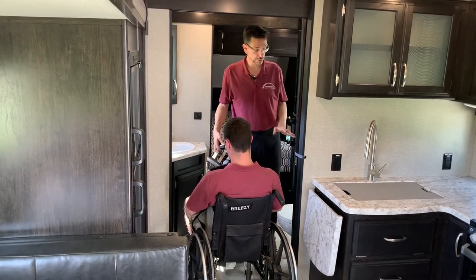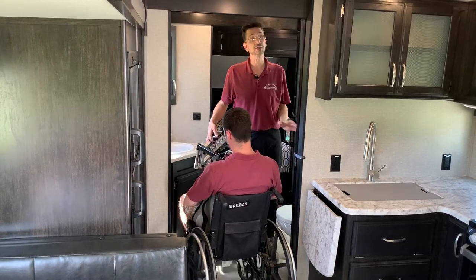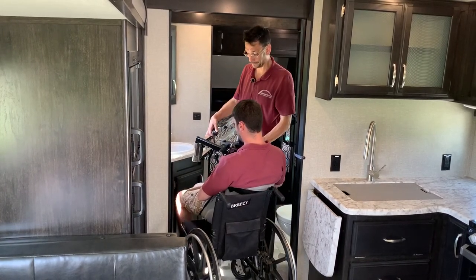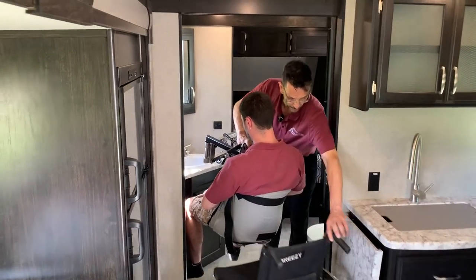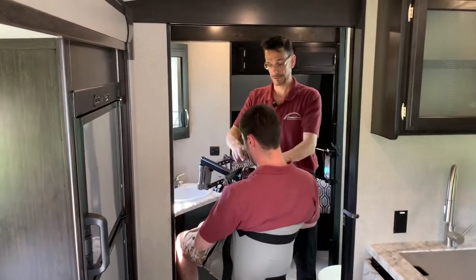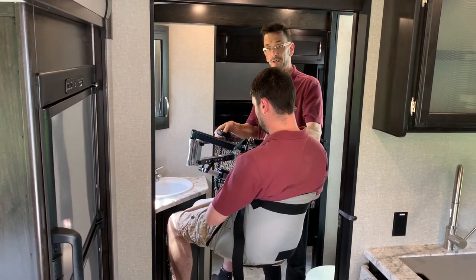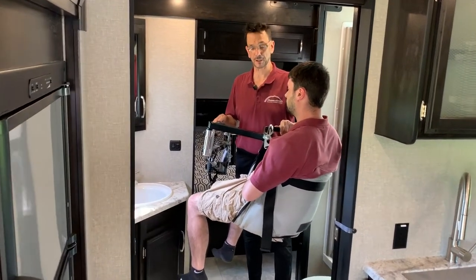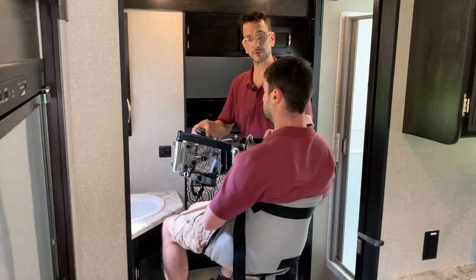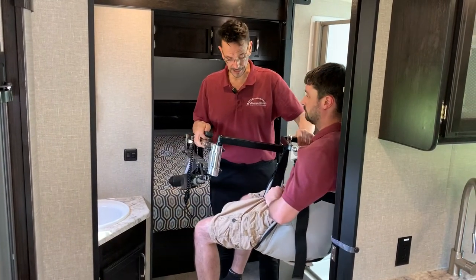Here we're going to show you how to transfer from the wheelchair onto the toilet, and then we're going to continue on into the bedroom. Moving toward the toilet now — you'll notice that with all the different joints we have here, we can move anywhere we want to go, turn, rotate — very easy operation.